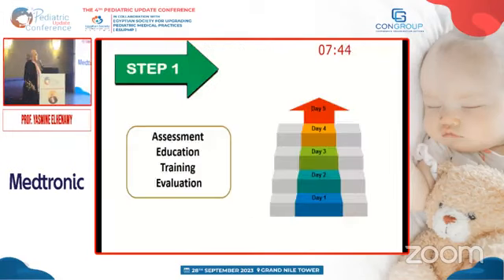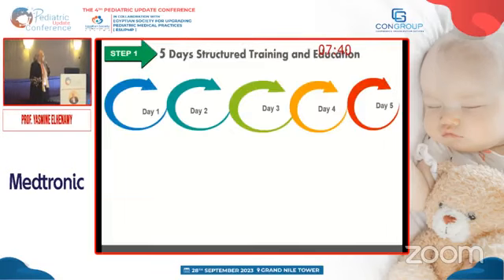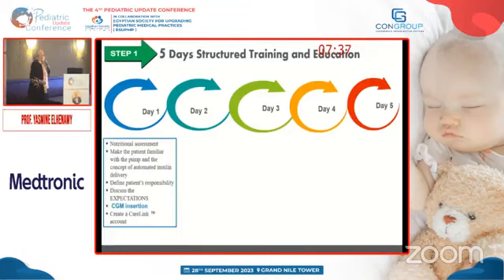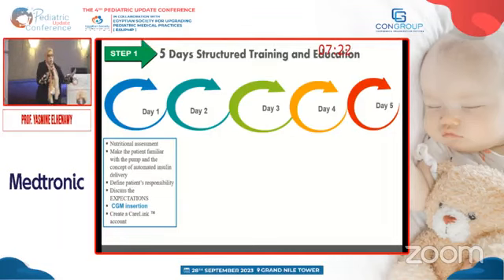طب احنا بنعمل ايه في الستبس دي؟ احنا قلنا step 1 اللي هي education with the cornerstone. Usually it is a 5-day steps. بنمشيهم ازاي؟ اليوم الاولاني بنعمل nutritional assessment، ولو العيان احتاج مني psychological assessment بعمل له psychological assessment. العيان بتجد familiar مع البامب والزراير بتاعتها. مهم قوي قوي قوي في day 1 اقول له responsibility بتاعتك. This is not magic. You still have to do work بس هتعمل less work.